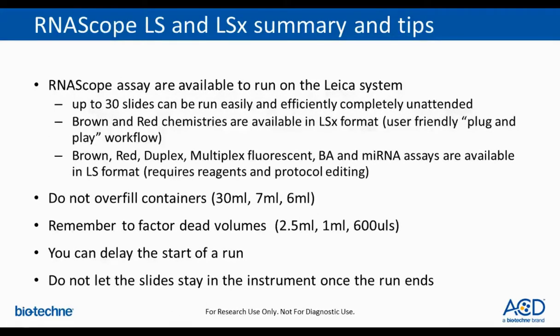I recommend you please fill the containers in the proper way as per the manual. We have the option of 30 ml containers, 7 ml containers, and 6 ml containers, and especially for the 6 ml containers, if you're loading just what you need for that specific run, do not forget to factor in the dead volume, which is 600 microliters. So you need to put in that 6 ml container whatever you need, plus 600 microliters.